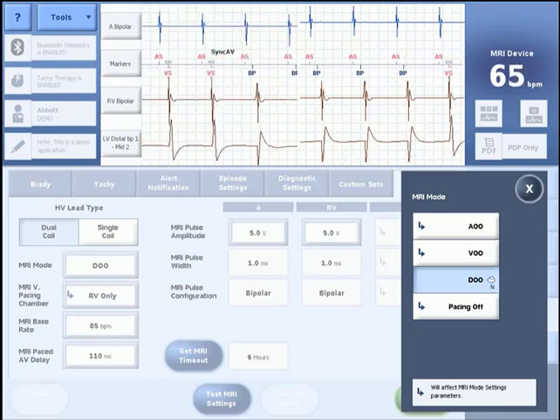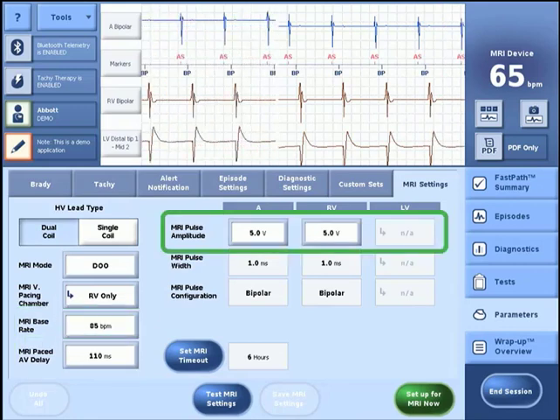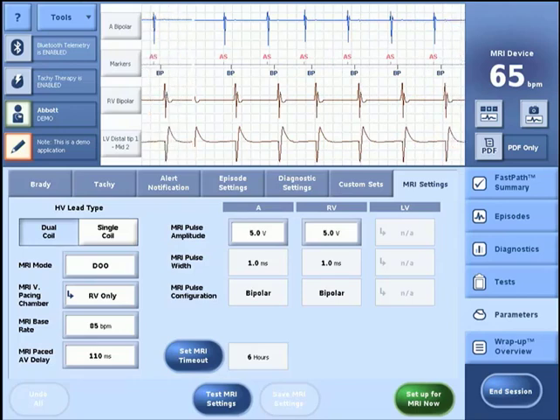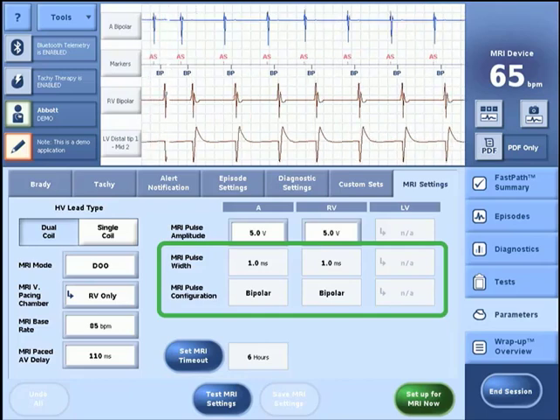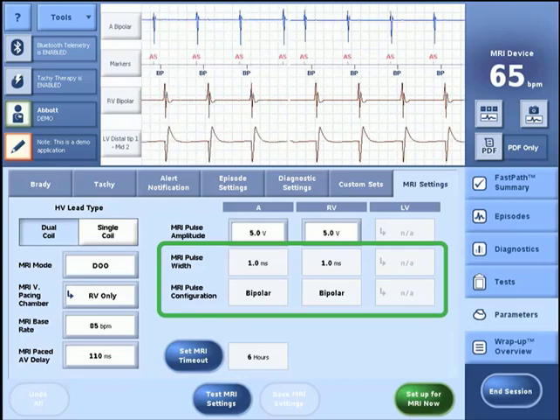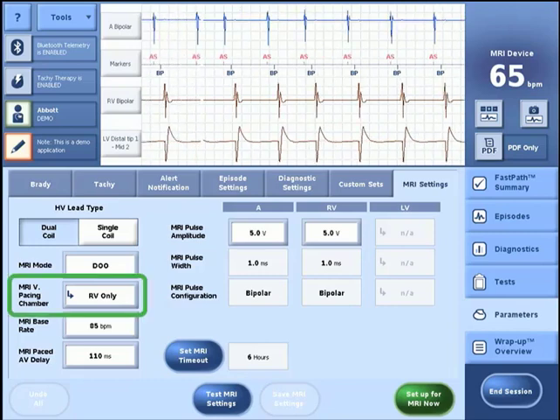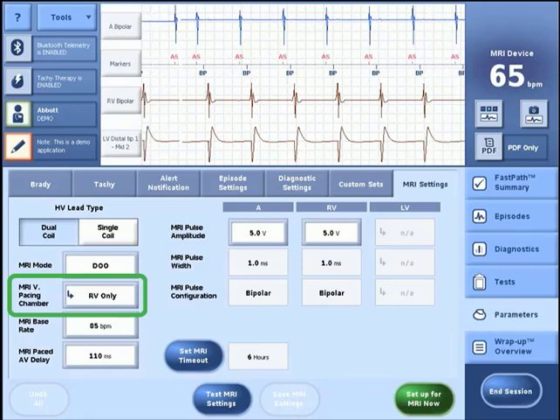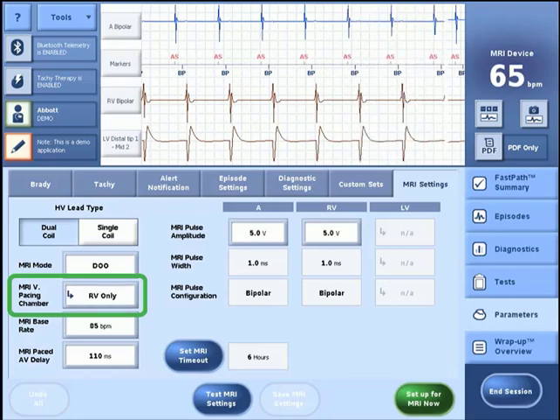If a pacing mode is selected, MRI base rate, MRI paced AV delay, and MRI pulse amplitude parameters may be adjusted as appropriate for the patient. For RA and RV lead positions, the MRI pulse width and MRI pulse configuration are not programmable. The nominal setting for MRI v-pacing chamber is always RV only. For some CRT devices, MRI v-pacing chamber is a programmable parameter with the ventricular pacing options of either RV only or simultaneous biventricular pacing.